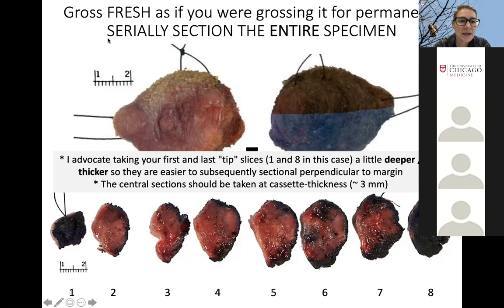And so let me annotate here. When histology cuts these, when they embed and cut them, if you cut it really narrow and give them tiny little pieces, it's actually harder for them to embed nicely so that we see mucosa, margin, cut.